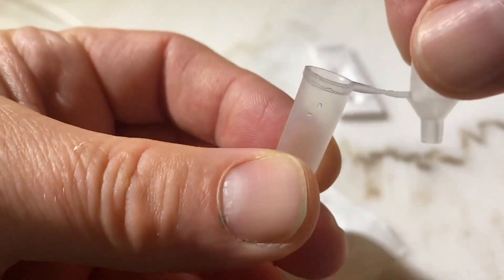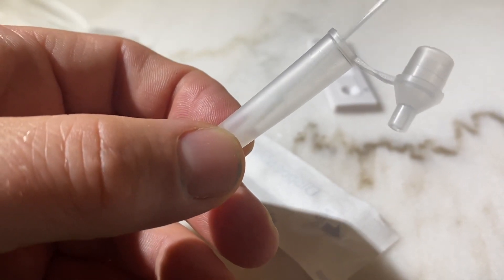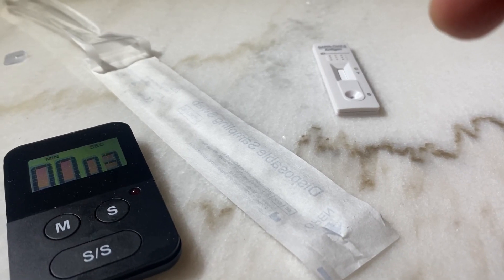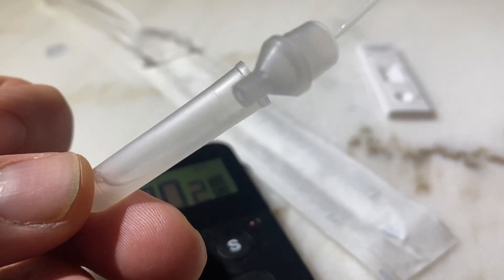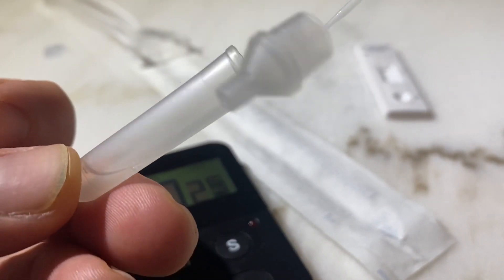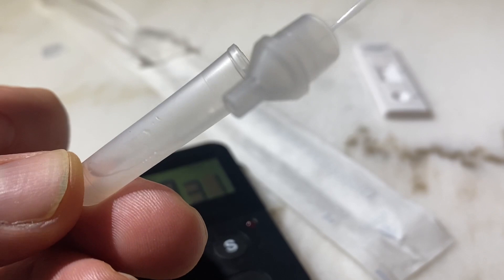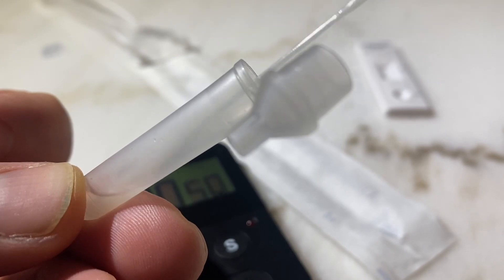Now get hold of your solution, open it up, and immerse the cotton swab into the solution. You should roll it around for three to five turns over the course of one minute. Make sure the liquid inside the container is covering the entire piece of cotton that's been inside your nose. Be strict with keeping these times so that you follow the manufacturer's instructions — that's the full one minute.